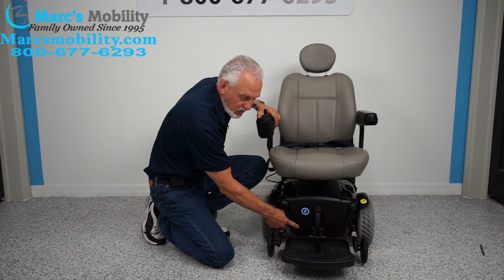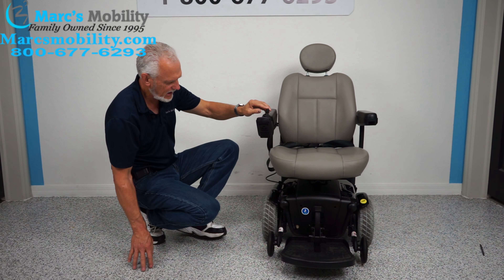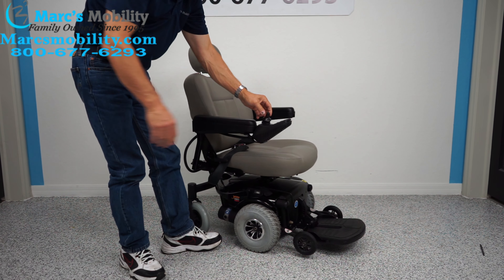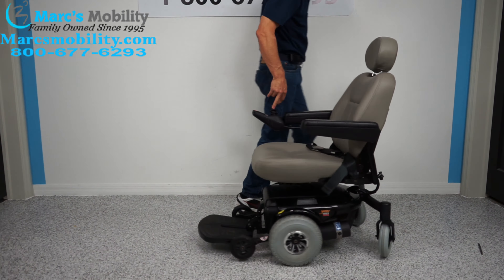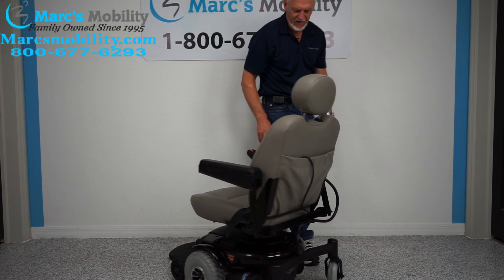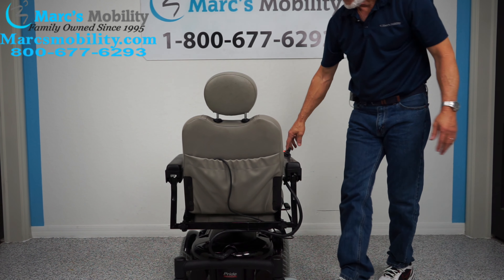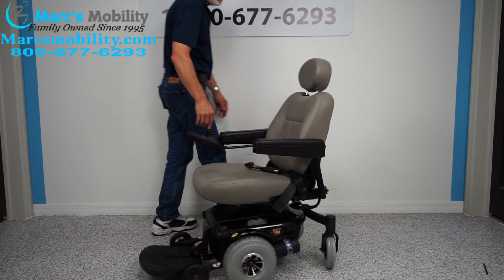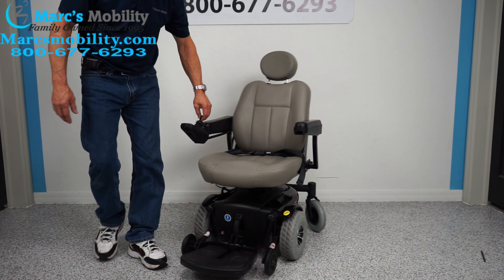Looking at the front and side of the chair, it's black in color. We have 10 inch solid wheels, caster wheels in the back, and tip wheels in front. This chair has what's called active track suspension — your front tip wheels are tied to your motors. If I lift this wheel right here, you can see the motor back there with a spring, and each wheel has an independent motor.